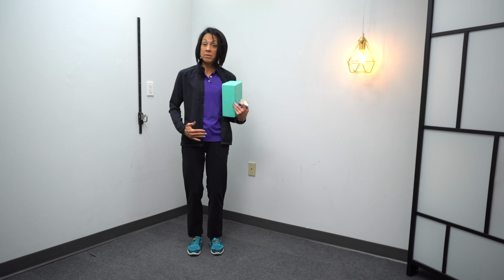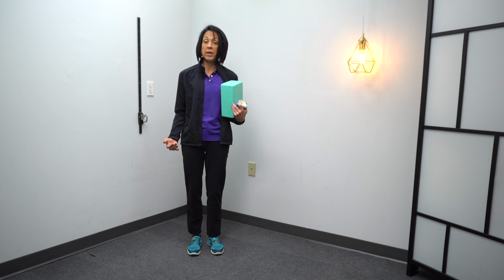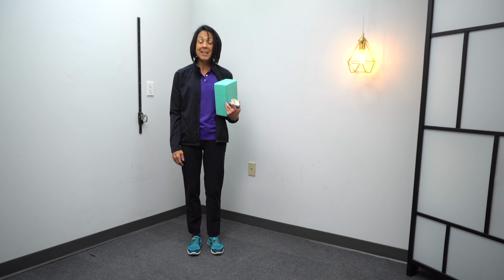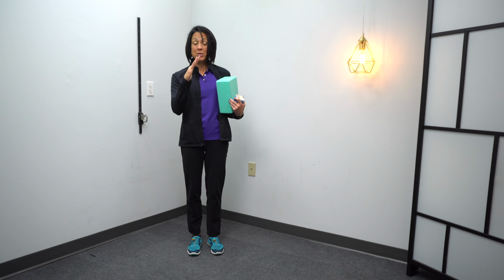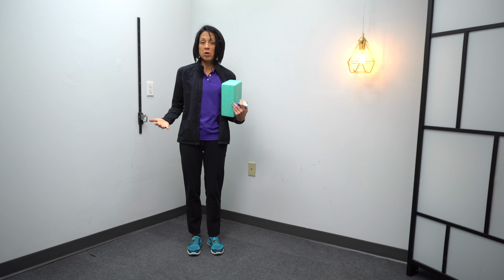So that's one set of tools that we will need: how do you keep the knees in? The other set is how do you keep the knee unlocked, so not allowing the knee to lock out, and we have tools for that. And then also, if you have a lot of inversion, or you walk on the outside of your foot, we do need tools to not allow that to happen. So what we want to do is force more of the weight towards the arch of the foot, and there are tools for that.